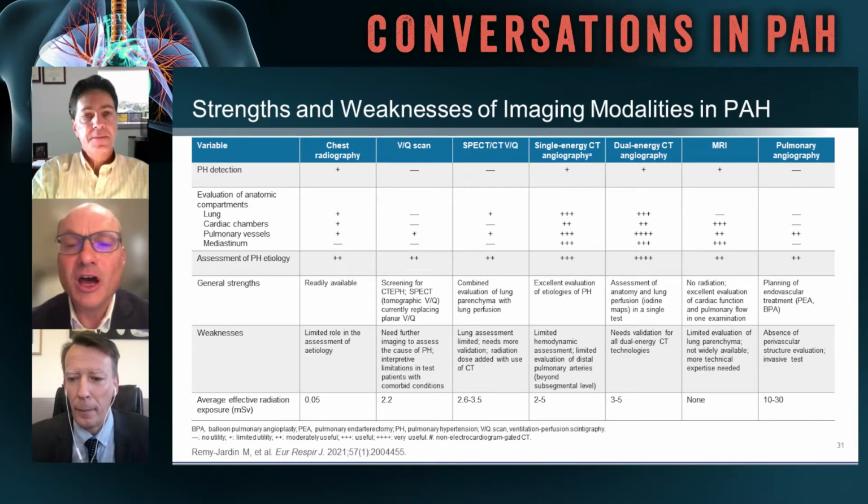We use MRI usually once a year, and the advantage here is we can compare this with our 3D echo measures, but we get a cardiac output measure that I think is fairly accurate. And then some groups are starting to look at septal curvature.